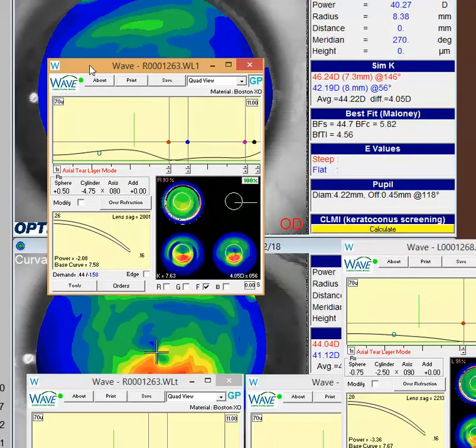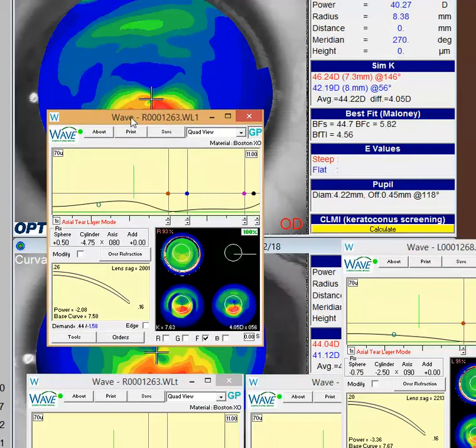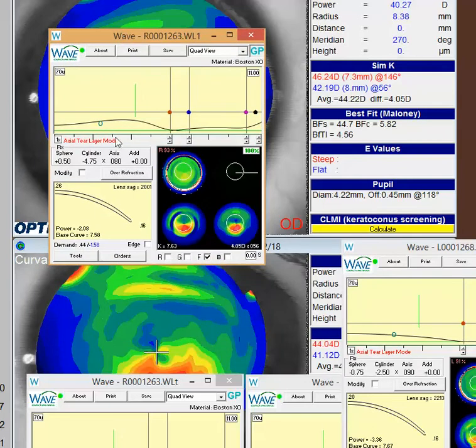One of the things I strive for, well, first of all, in these keratoconus lenses, you'll find they're a little bit more challenging and some of the rules go out the window. But I think you did appropriately. It chose the free form because you're a little off center with your cone. And what I would probably do is I want to get this back surface of the lens.